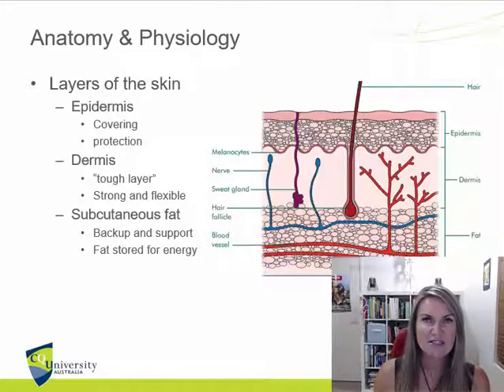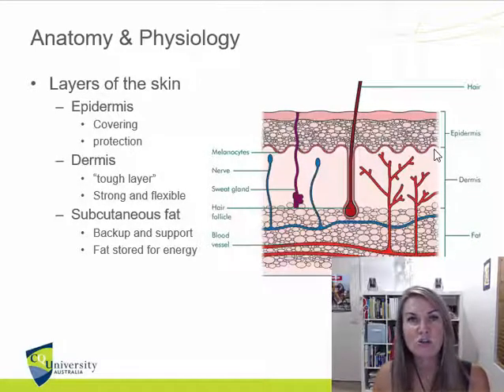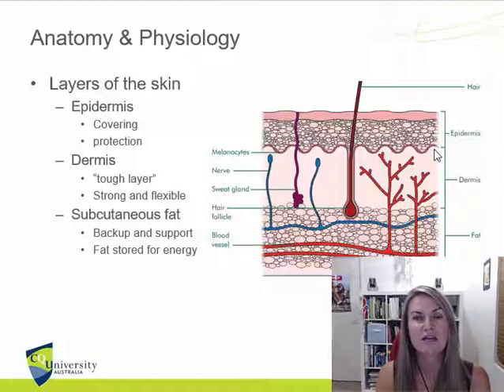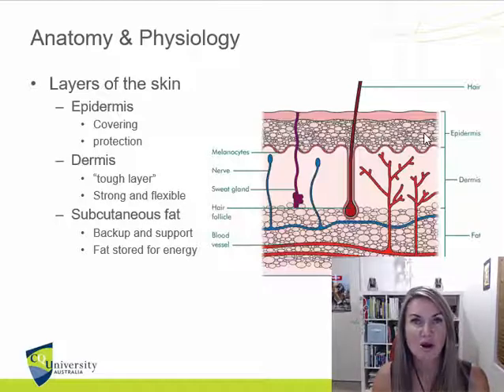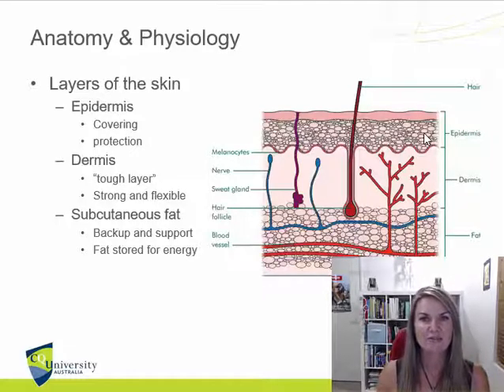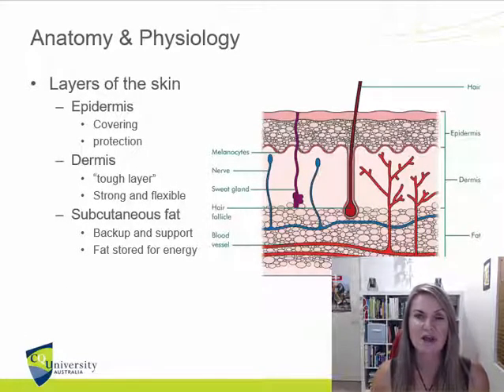So the epidermis, hopefully you can remember that that is the thinnest layer. As we can see up here, it's often where you're going to see tracks for foreign bodies. So you may not actually see the foreign body, but you'll see these anechoic little tracks of fluid that are going through that very, very superficial layer. So you know, hopefully skin layers, they're for protection and for covering, and that's basically where you're going to see some signs of damage as well.